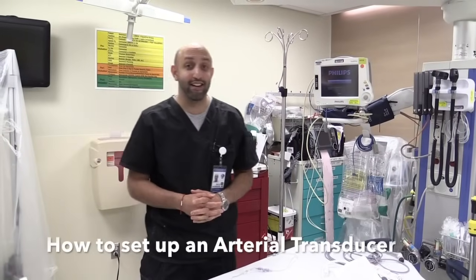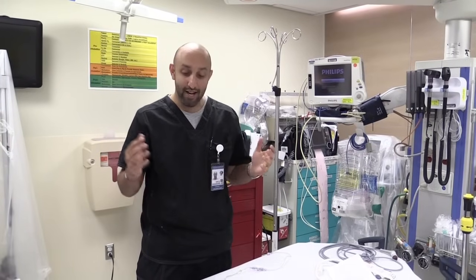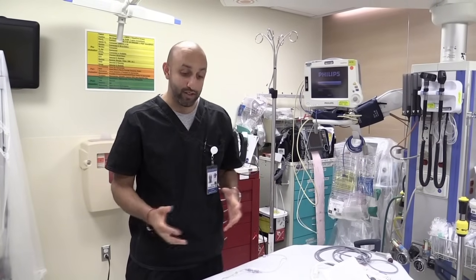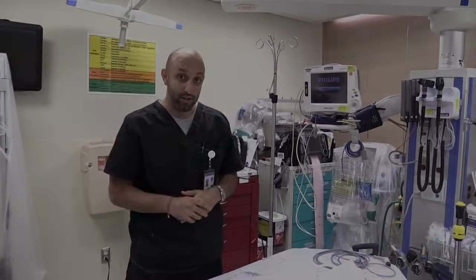Hi, my name is Silo Bindari. I'm an attending here at NYU Medical Center in Bellevue Hospital and I'm here with a video from EM Core on how to set up an arterial transducer. We often times put in arterial lines, but we leave up the arterial transducer set up to our nurses. However, the point of this video is to show you all how to do it yourself.